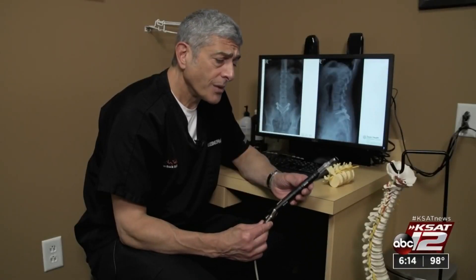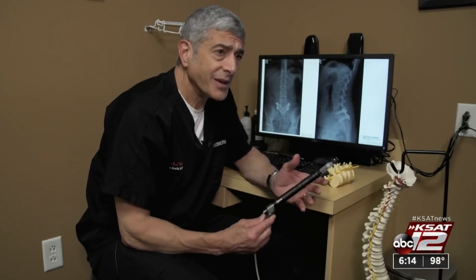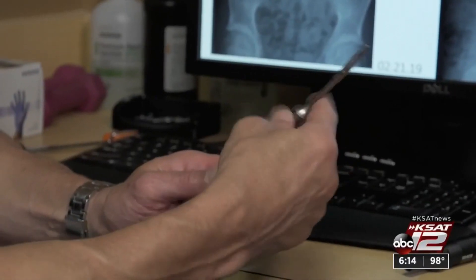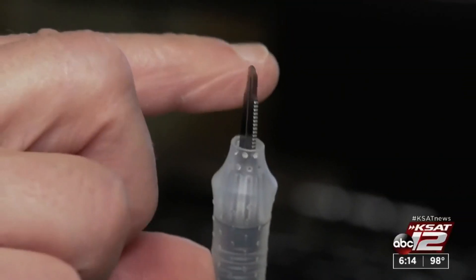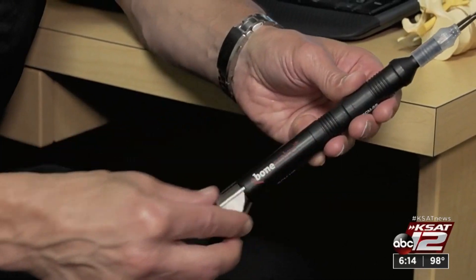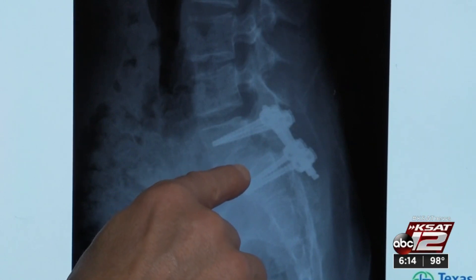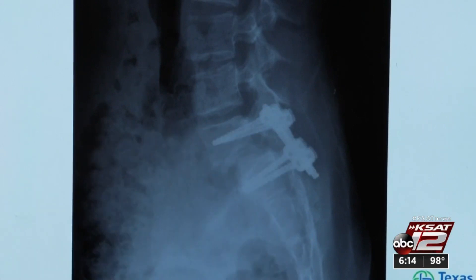This is the ultrasonic bone scalpel. As one of my former fellows said, this is the game changer. The ultrasonic bone scalpel vibrates 22,500 times per second to precisely cut bone, but the tip is not sharp and bounces off soft tissue — so it's a safer, less intrusive way of doing spinal surgery. That's her bone that I used the ultrasonic device to fashion so it's a perfect fit, and then the screws and the rods.